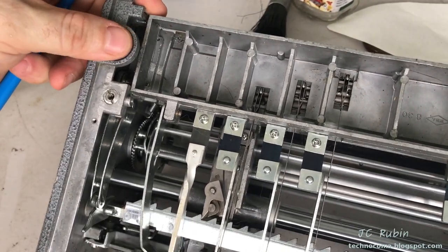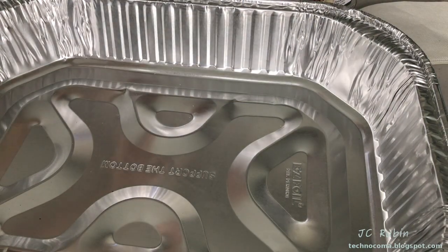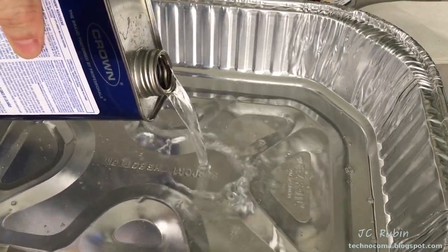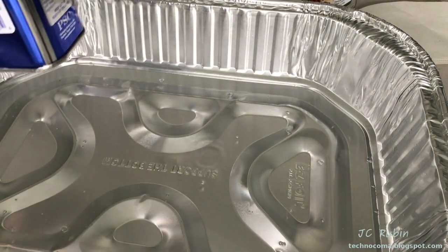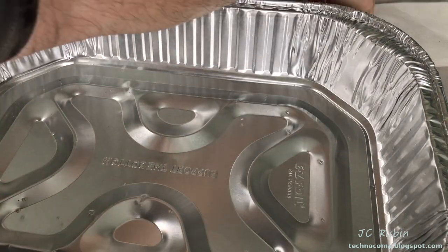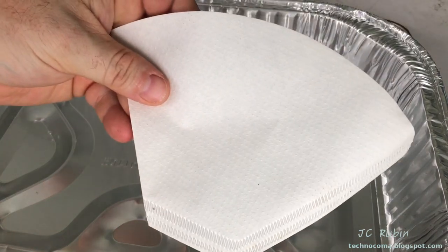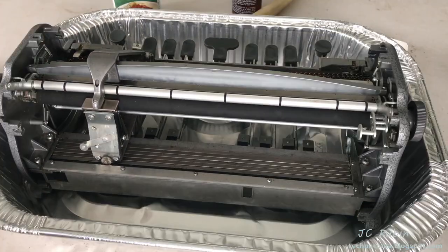I purchased an aluminum pan from the supermarket for the next step. I've got my kerosene — I pour some into the pan outside, as kerosene smells horrendous. Just enough to cover the bottom of the pan. I also have a glass jar and coffee filter: depending on how dirty the kerosene gets, I may filter it and reuse it. Now I place the brailler into the pan.